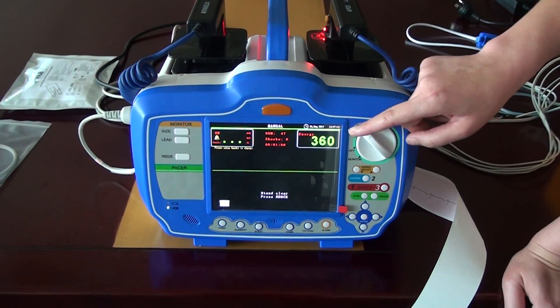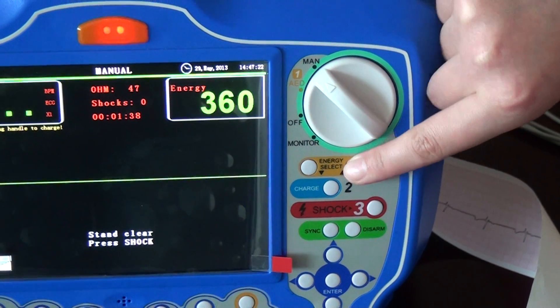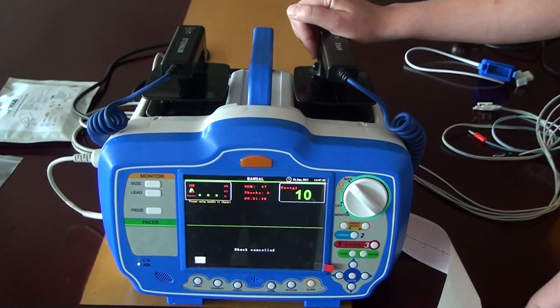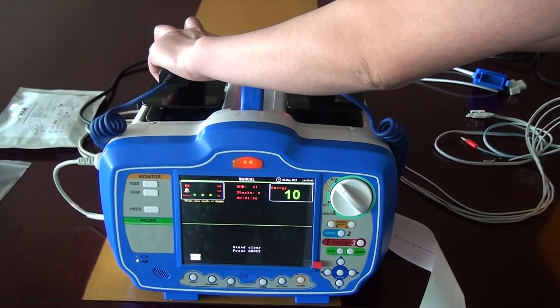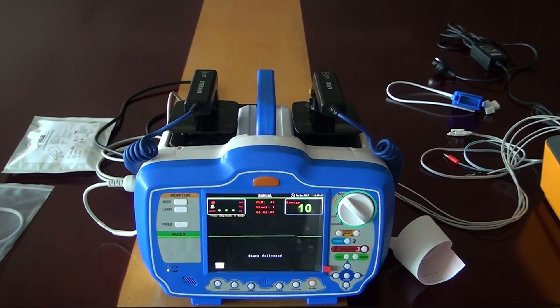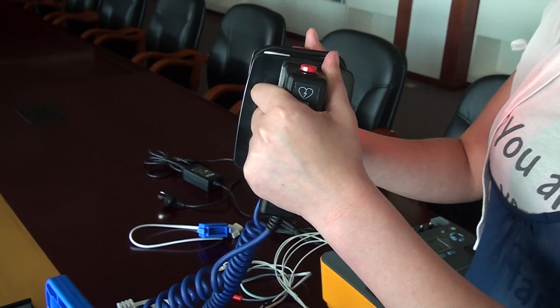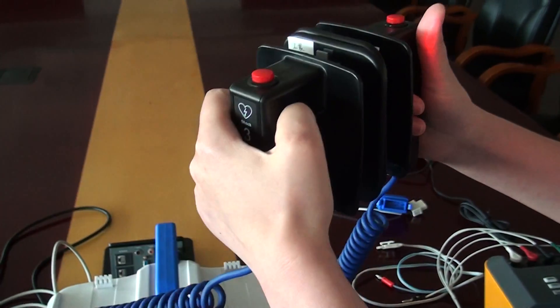We usually do not use the energy at 360 joules — we use less energy. To select it, do a self-test: press the yellow button until it turns red, then press the red button to shock. One important thing to remind the customer: after pressing charge, please do not put the handles together to shock, because it is very dangerous and may damage the device due to a short circuit.